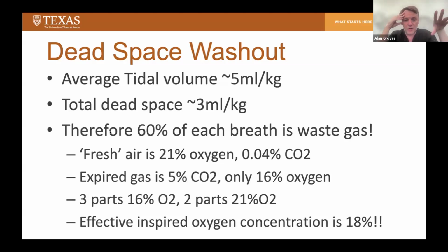But I just want to point out that as a baby is sitting not on any respiratory support, 3 parts of its breath are 16% oxygen, 2 parts of each breath are 21% oxygen. So the effective inspired oxygen that gets down to the baby's lungs is 18% rather than 21%, because 60% of each breath is 16% oxygen rather than 21% oxygen. So although we think of all babies as breathing 21% oxygen, in fact, our babies are probably breathing 18% oxygen.